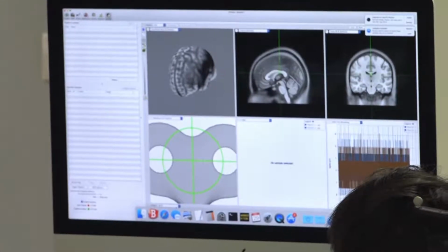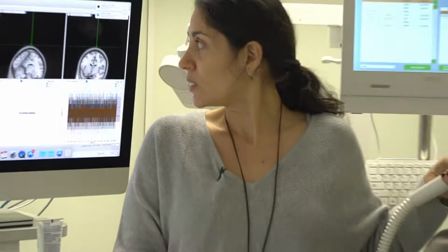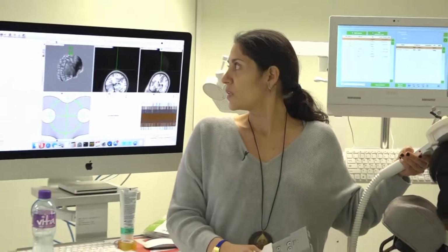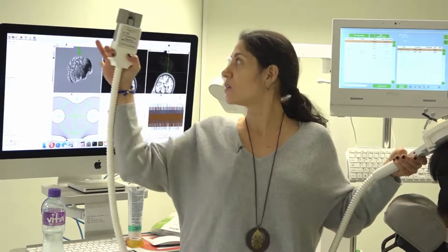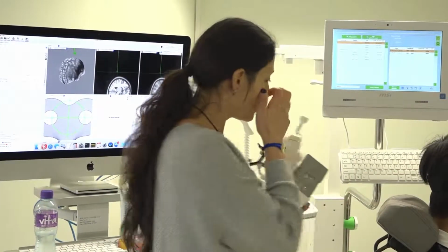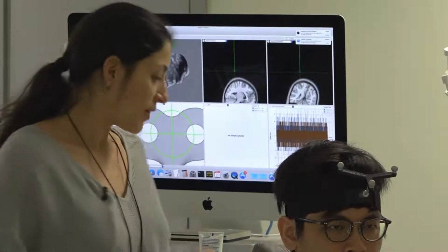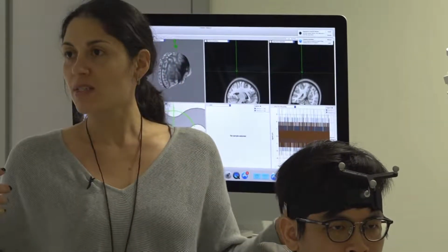And then this will tell me where the coil is located. You see? It appears. Can you see it here? The coil appears. Okay. Now let's go to TMS. Let's TMS Joseph. Several things. This is just preparation stuff.